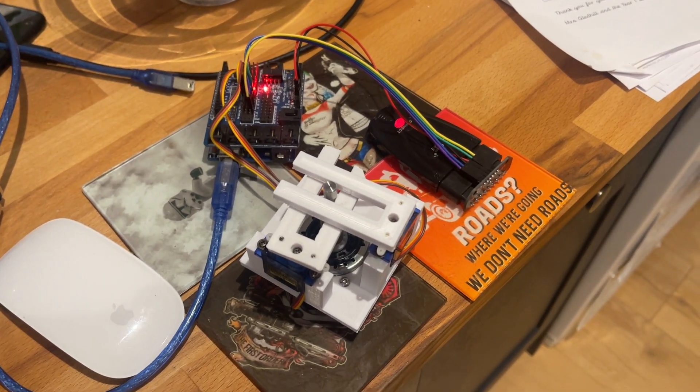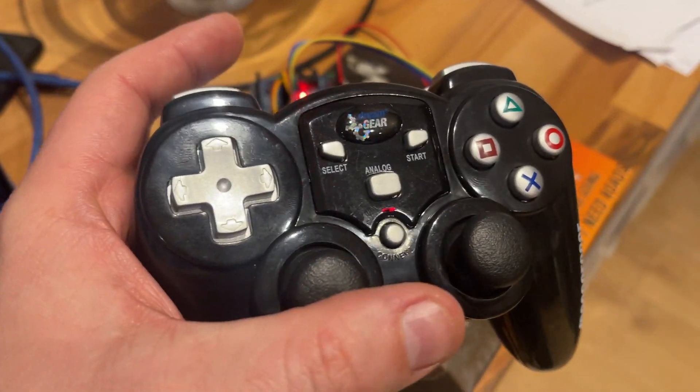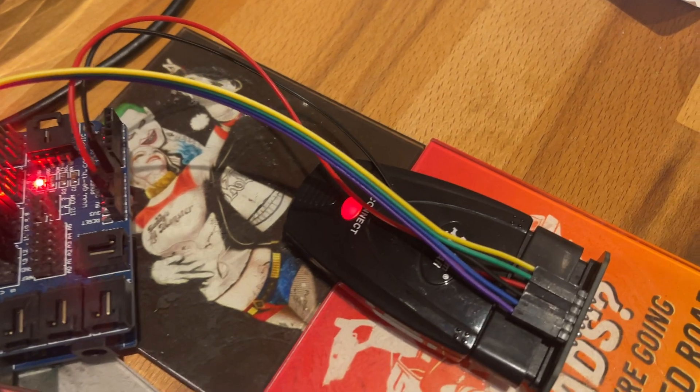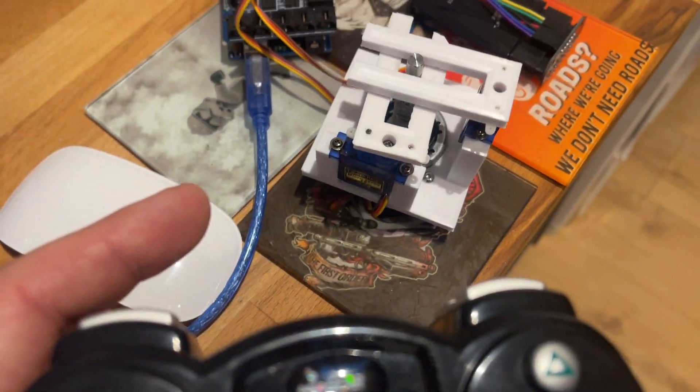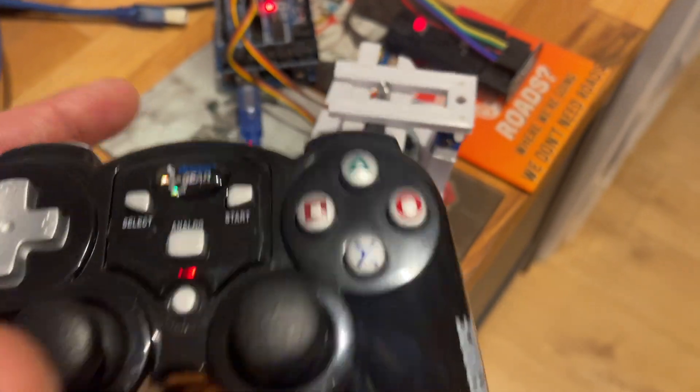Small update on my electric wheelchair project. The idea is to make it remote control. I've managed to invest in a PS2 controller and a sensor which I've got from Aliexpress. And what this allows me to do is just read the values from the joystick.